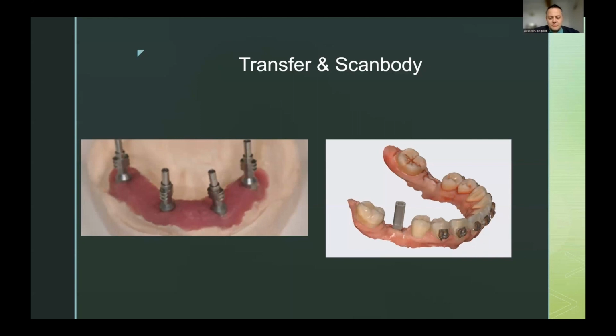Of course, what we scan is never perfect, and the scan body there is going to have data that is sometimes bigger and sometimes smaller than the actual physical object that we scanned. But the computer is able to take the perfect dimension of the scan body and try to place it inside our scanned mesh as closely as possible. So actually it's triangulating this library inside our mesh.